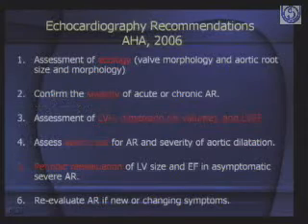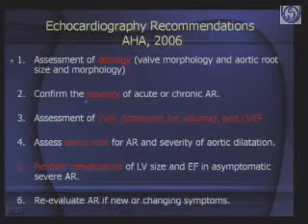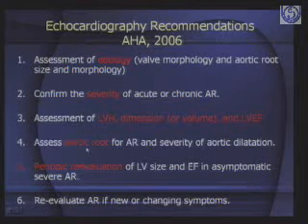Point 2, confirm the severity of AR. Is it acute aortic regurgitation or is it chronic aortic regurgitation? Number 3, assessment of left ventricular hypertrophy, dimensions or volume and LV ejection fraction. Assessment of aortic root for AR and severity of aortic dilatation.